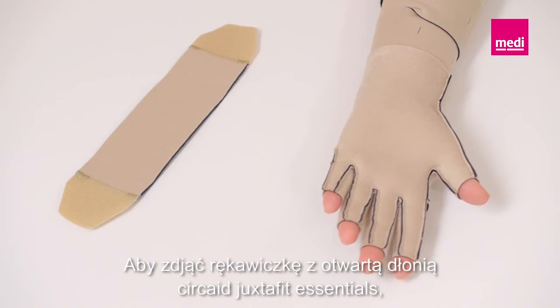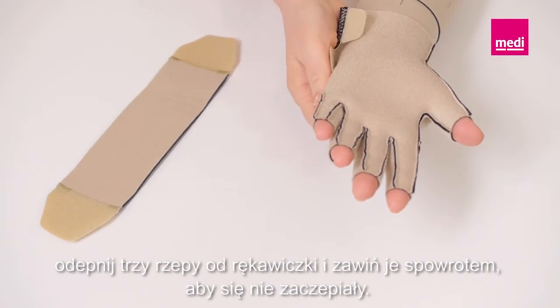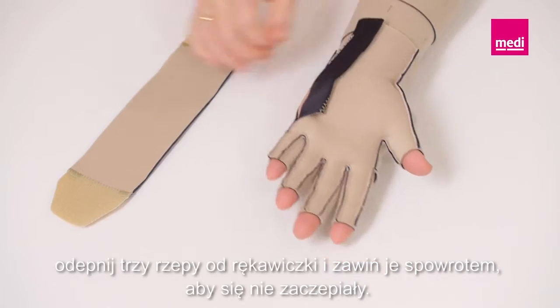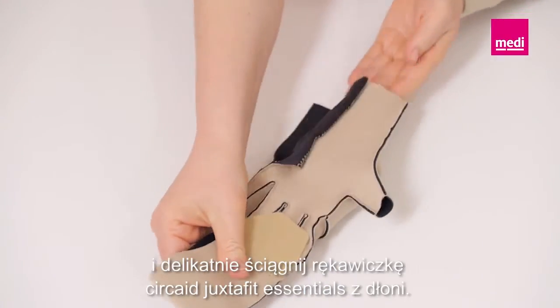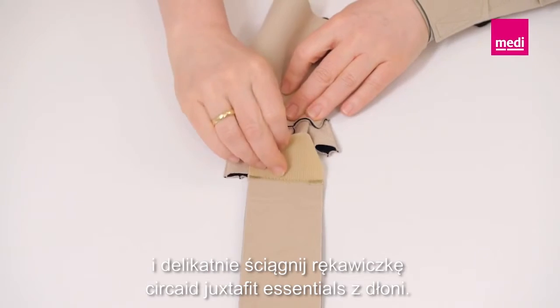To remove the Circade Juxtafit Essentials open palm glove, detach the three Velcro tabs from the glove and fold them back onto themselves to keep them lint-free. Attach the removal band to the front and back of the fingers and gently pull the Circade Juxtafit Essentials open palm glove off the hand.